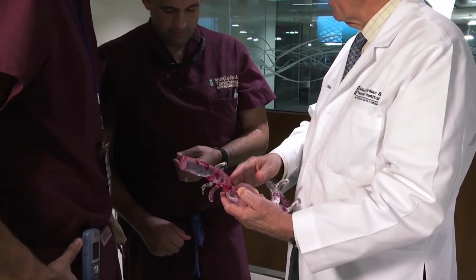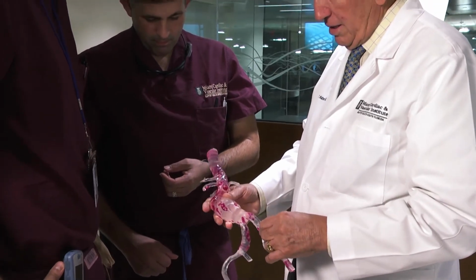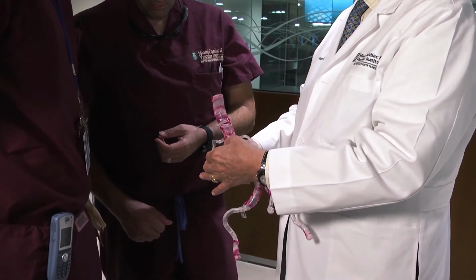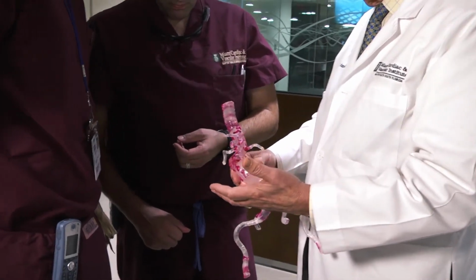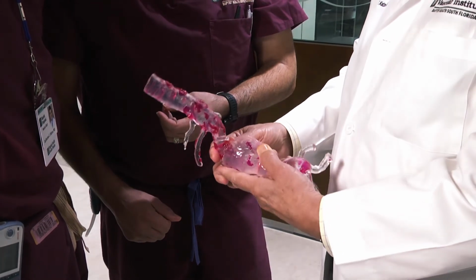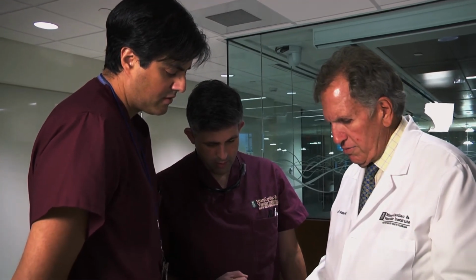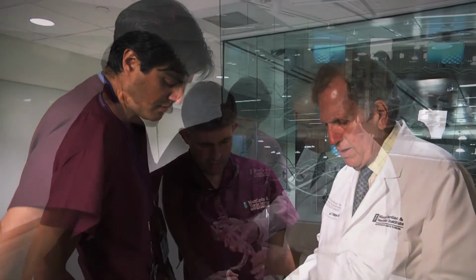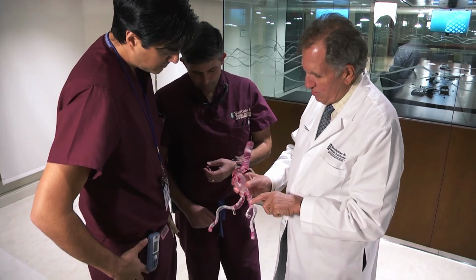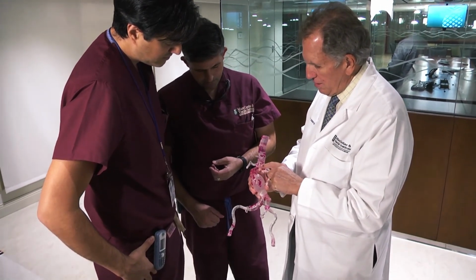Being able to see a 3D model shows us a lot of things, especially as it relates to heart and circulatory problems. When we're treating aneurysms, arteries curve a lot, they angle a lot, they're very complex. And we've seen a number of situations where by looking at the 3D model, we actually change our device selection or change our approach or in some way alter our treatment plan for that patient. So I think it's going to offer a lot of potential for improving patient care in that way.